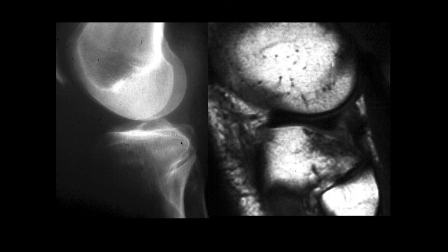Once you see the MRI, you get a little bit more of a view of the fracture on the X-ray. You see the increased signal below that area. This wasn't picked up prospectively on the X-ray. He then did an arthroscopy on the patient, and he thought this guy was normal. No. If you go to the left image, John, the X-ray image, there's an area of sclerosis type signal right adjacent to the fibular head, right in there. I think that's part of the fracture. That's a compressed trabecular bone right in there.